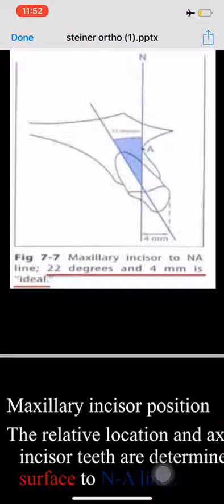فشاف انه هاللونج اكسس اوف ذا دنتال اذا راد دكتور انجل يرسم perpendicular line يمتد من between nasion و point A، between nasion كسكليتال و point A اللي هي بالانتيريور سيرفيس اوف ذا maxilla deepest point. فشاف انه اللونج اكسس راح يسوي زاويه ويا الان اي about 22 degrees and there is a distance between NA line and incisal edge about 4 millimeters.